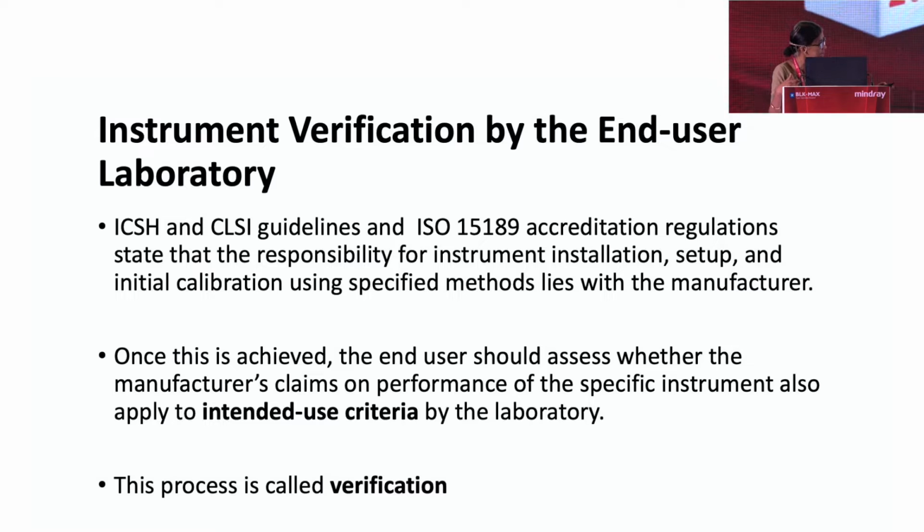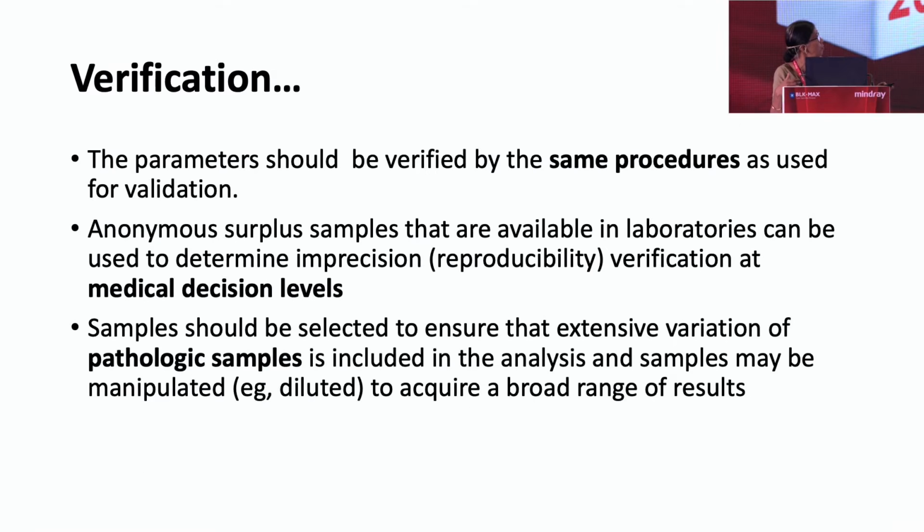However, once this is achieved, the end user shall assess whether the manufacturer's claim on performance of the specific instrument also apply to the intended use criteria by the laboratory. And this process is called verification. So the parameters should be verified by the same procedure as that used for validation.